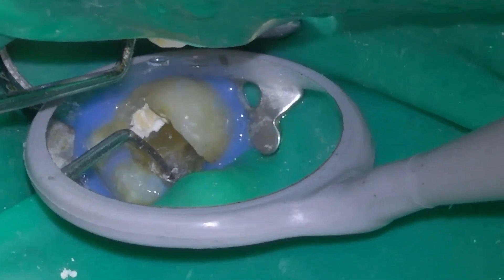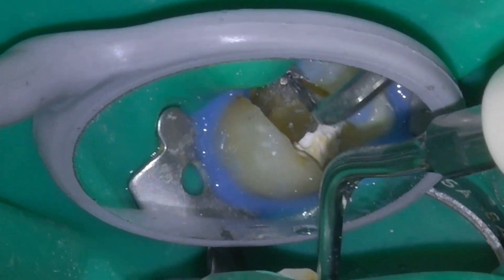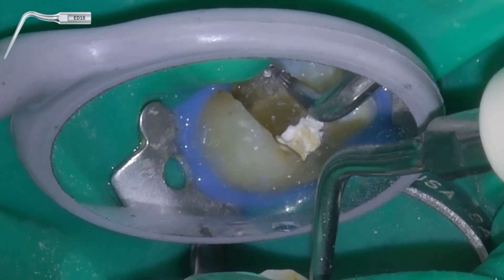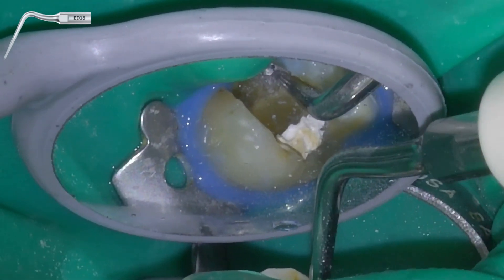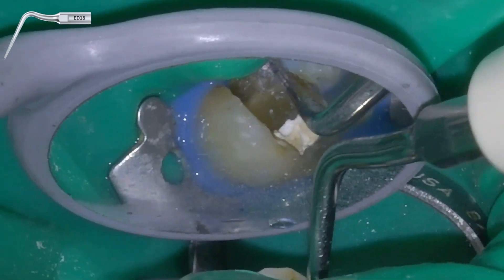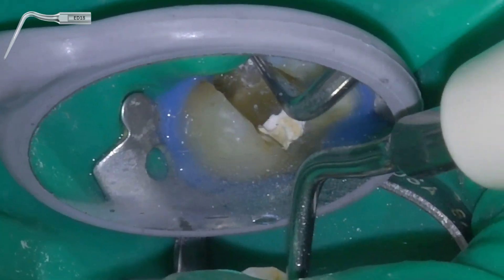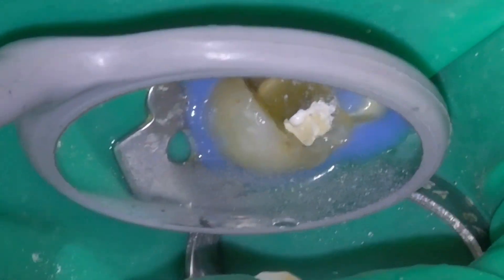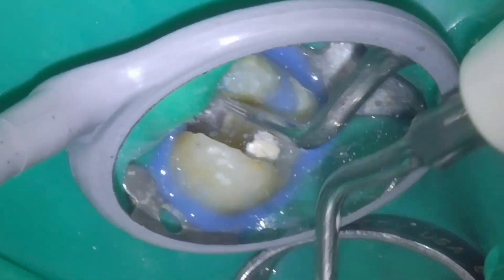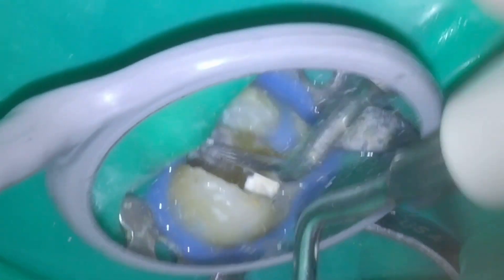To remove the fractured instrument, we will use low power with the ultrasonic tips — 4 out of 20 or so. The power level of the vibration must be very slight to try to avoid breaking the file into more pieces.